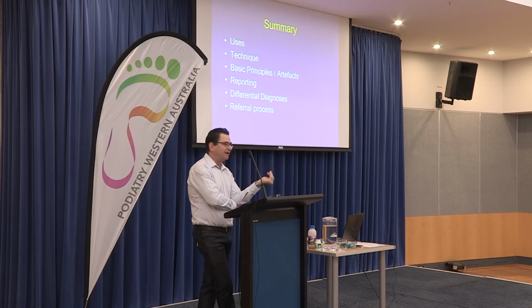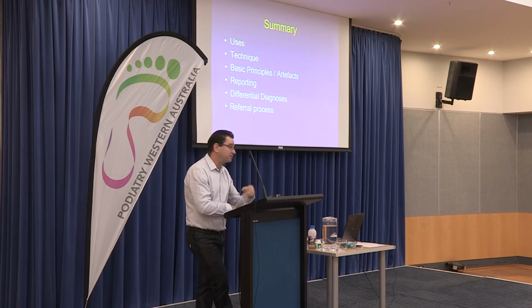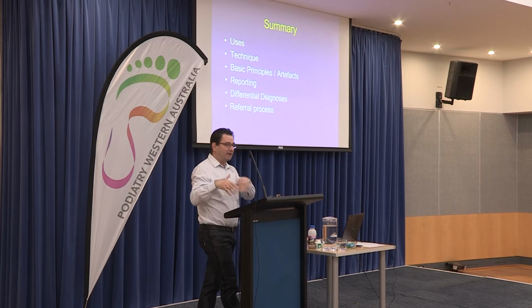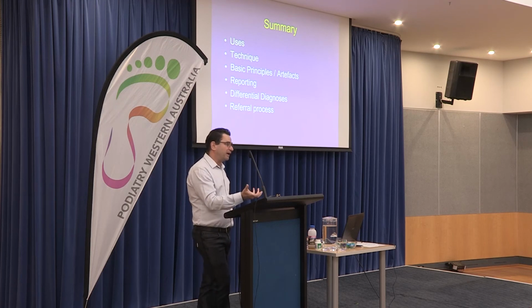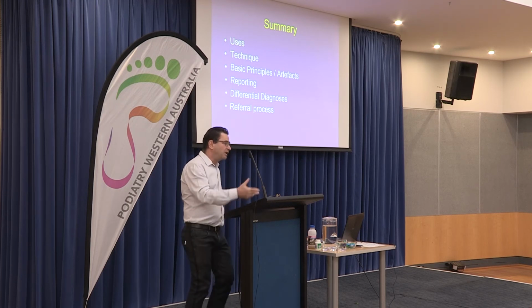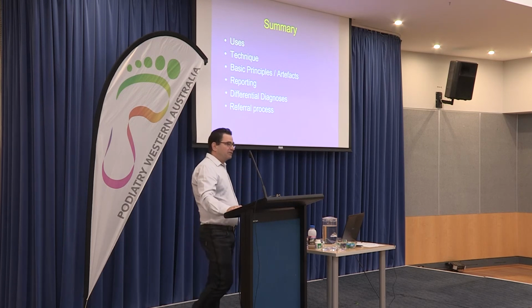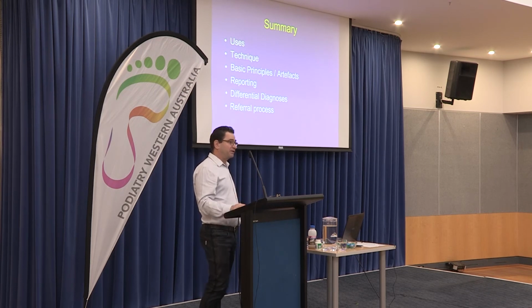And the other thing that we get at ultrasound that we don't get at MR is Doppler. I was asked to talk about Doppler as a Doppler test, but we obviously use Doppler for assessing hyperemia too. So we get all that extra benefit, like how hyperemic is the tendon. So when you've got tenosynovitis, the middle-aged women with the chronically everted feet, tib post tendinopathy, spring ligamentopathy, posterior subtalar arthropathy, that sort of syndrome that you've seen a bazillion times yourself.